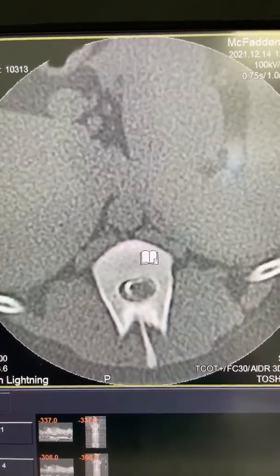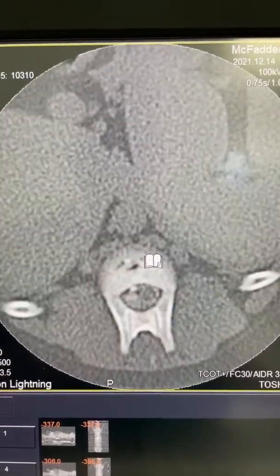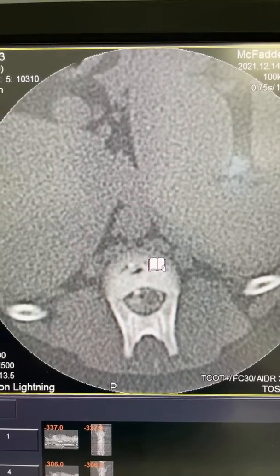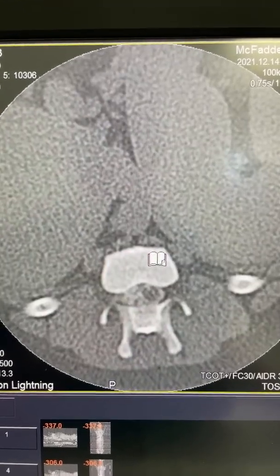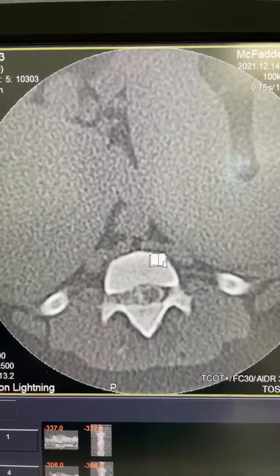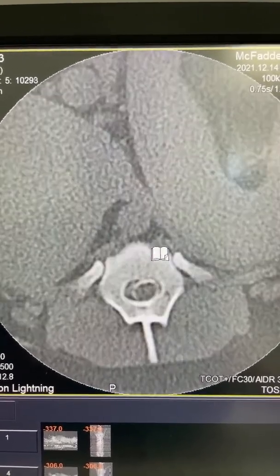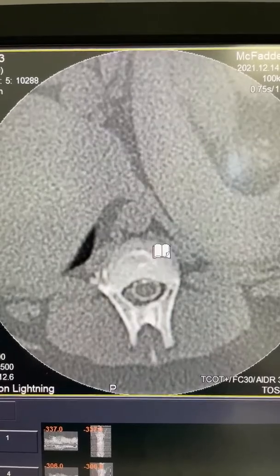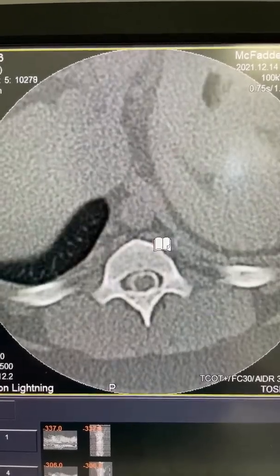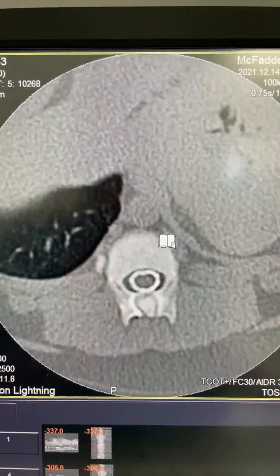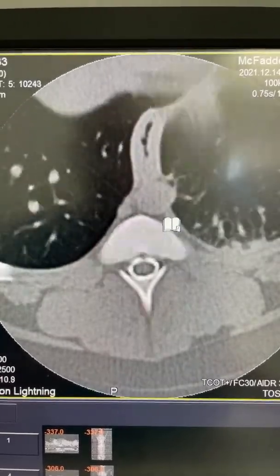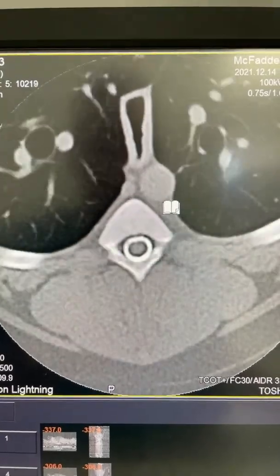At T13 we see some compression in the spinal cord with disc in the spinal canal, and then at about T11 we see that the contrast column is re-established.